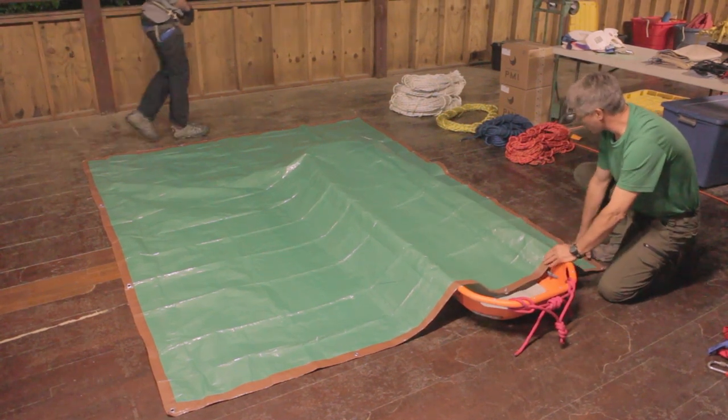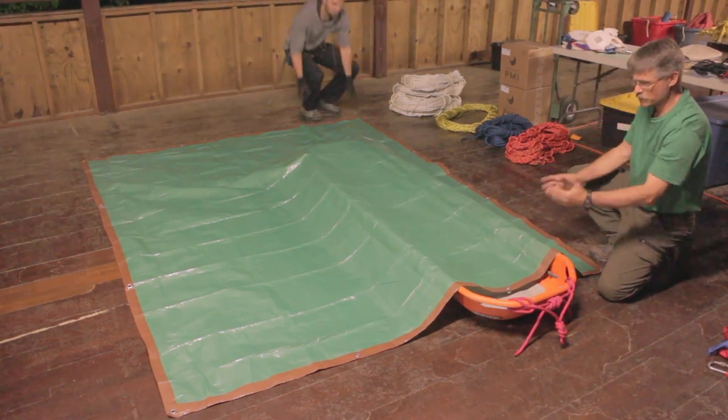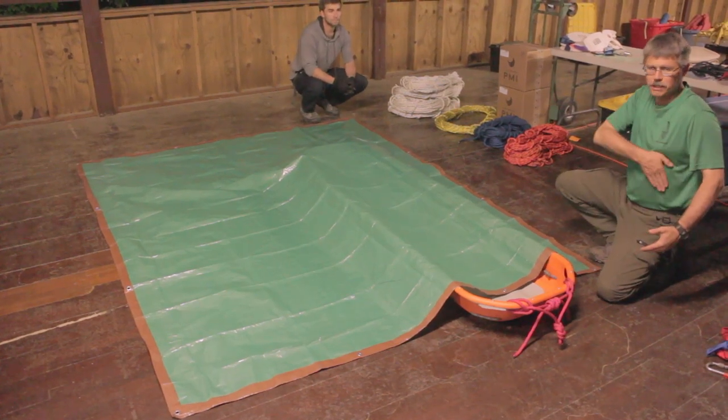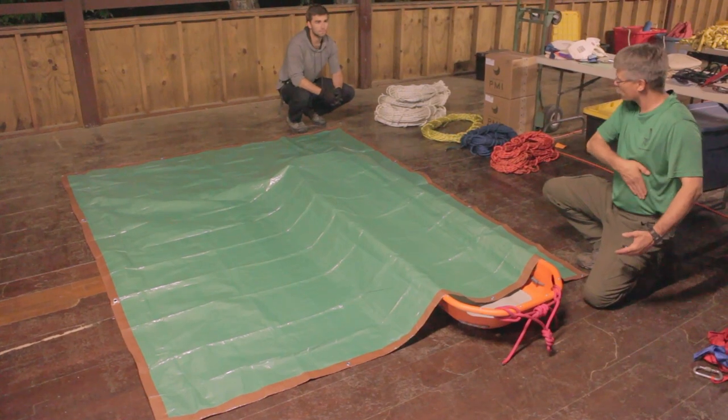We want enough of this tarp off on one side or the other — doesn't matter which — to be able to wrap around our patient and come just kind of slightly past their midriff and over the side.